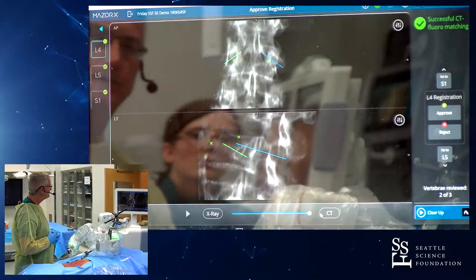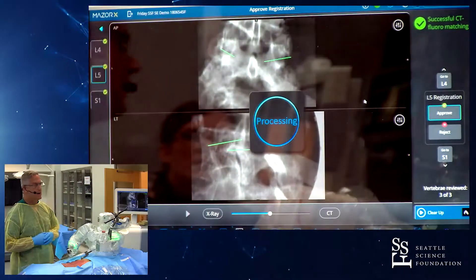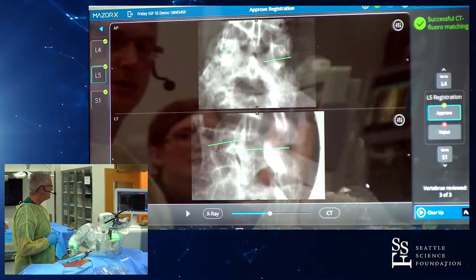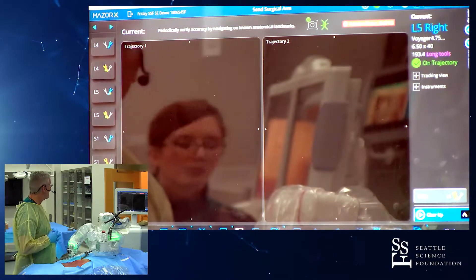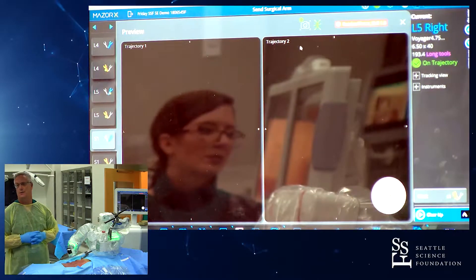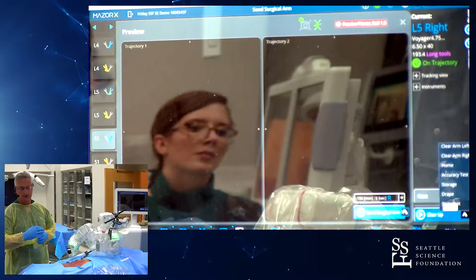We'll confirm that we have a good merge. I'm going to go through this pretty quickly — I think there's a huge benefit in hands-on time in the lab afterwards. So we'll start on my side at S1. After placement of the Schanz pin, we do a 3D volume which I call the iron dome.